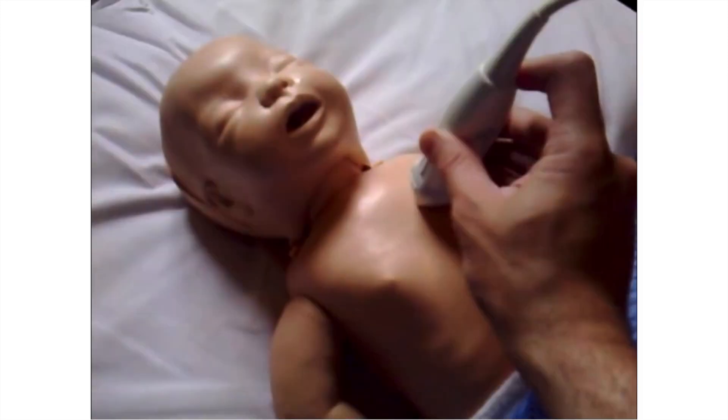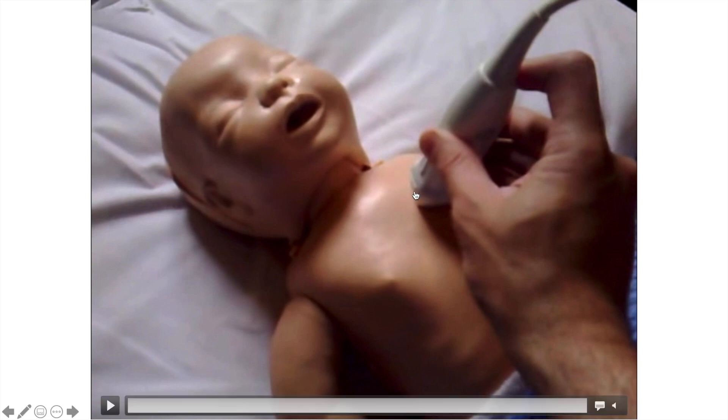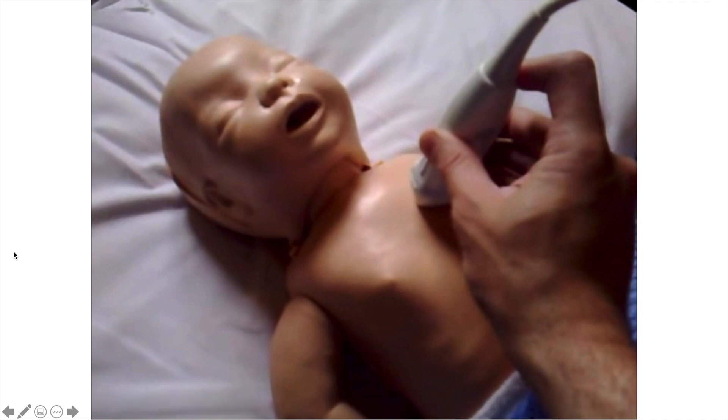How do we get it? We put the probe next to the left sternum, and the marker of the probe — the pointer — is towards the right shoulder. As opposed to the apical view, where the pointer was towards the left shoulder. This is how we get the long axis view of the heart.